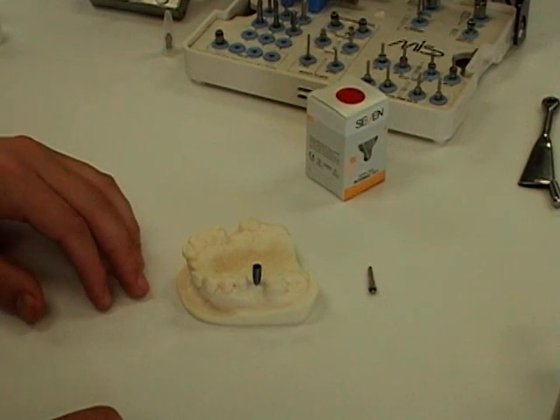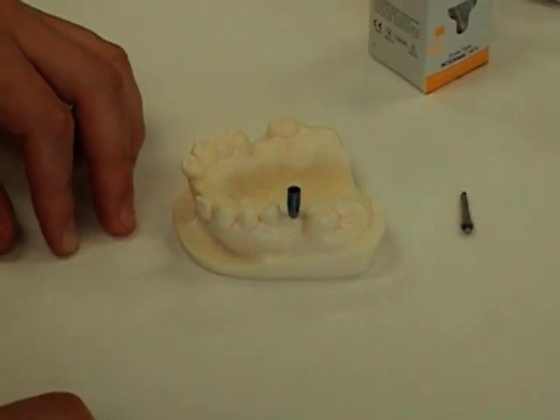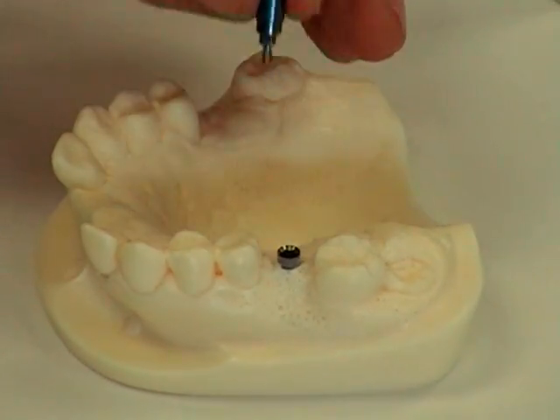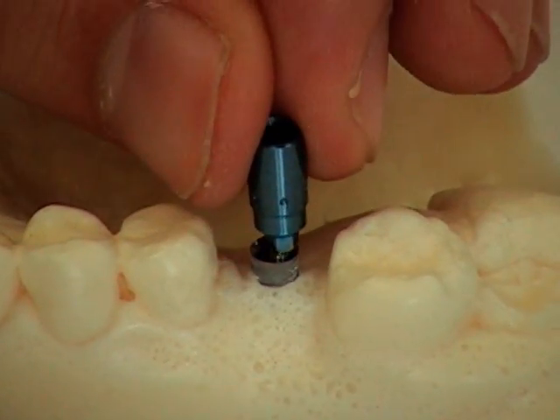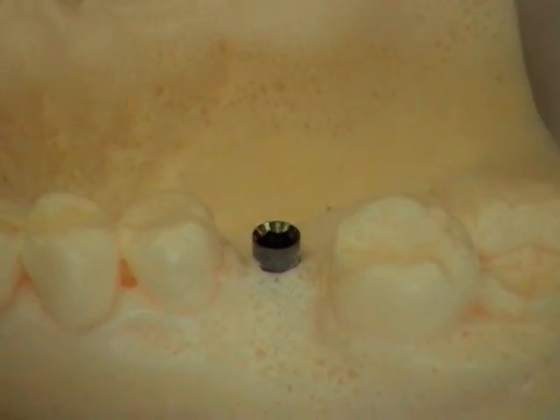What we're going to show now is the way to insert an implant directly without using the fixture mount. This may occur if you remove the fixture mount too early. As you see here, the implant sides are still visible. You could connect the fixture mount again and finish tightening it the rest of the way, or use a direct insert tool.